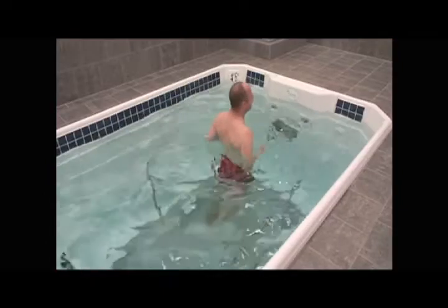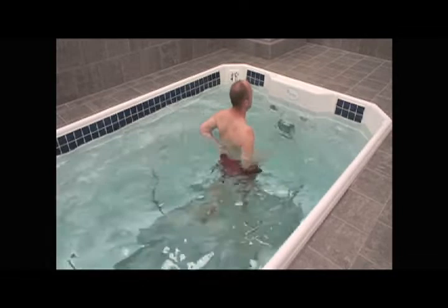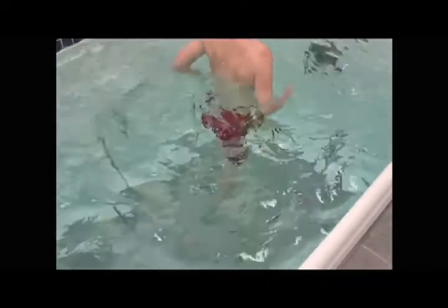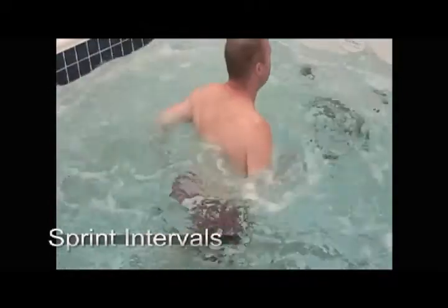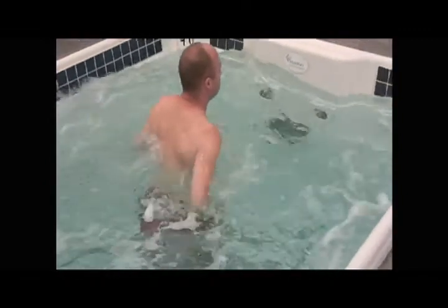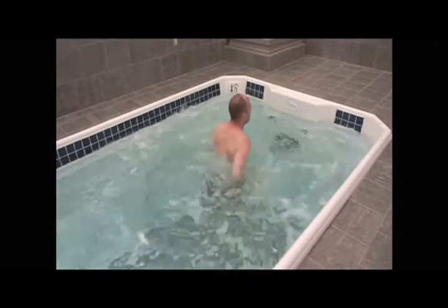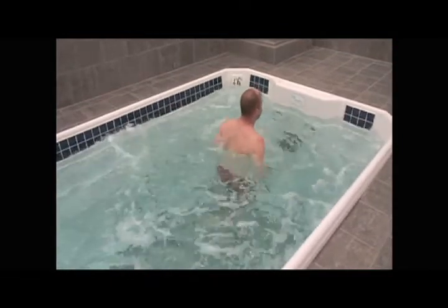The last two days in the pool before he returned to the court — jumping, running, all activities — we did sprint intervals. After a warm-up, we started at seven miles an hour with 30-second sprints and 15-second rests, all trying to simulate what he'd be expected to do during practice. We had resistance at 70%. He'd sprint for 30 seconds, then hop off the treadmill for a 15-second rest.